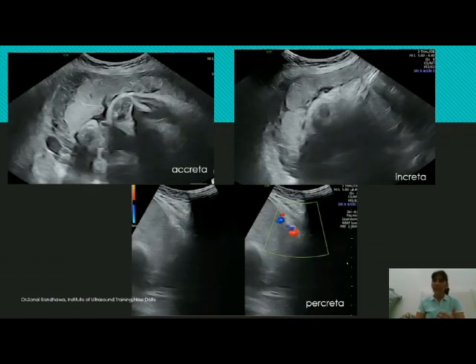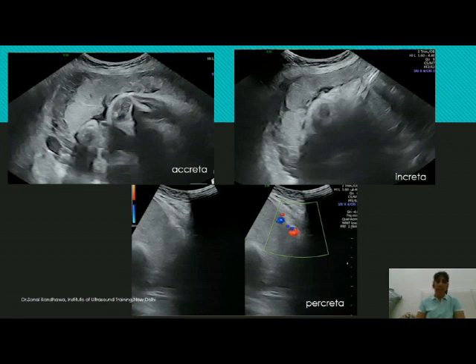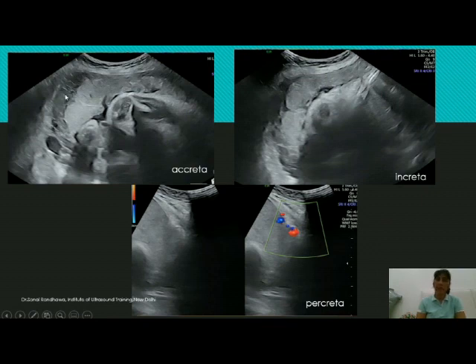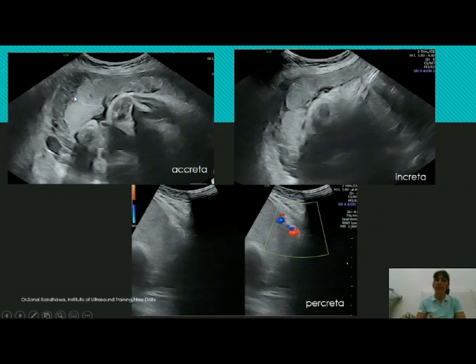Let us go to these pictures — all from the same patient, in whom you can see all three types of placenta creta. In the first picture you can see the placenta clearly, and the retroplacental space is not reduced or disappeared in this area — it is seen very well. But what is it in the retroplacental space that tells you this is different from a normal retroplacental space? Look at these white areas.